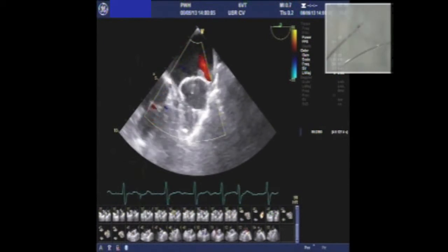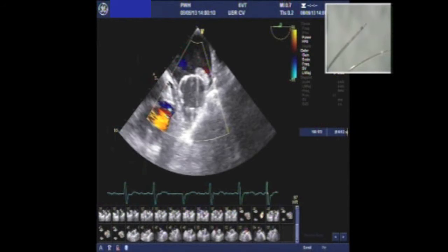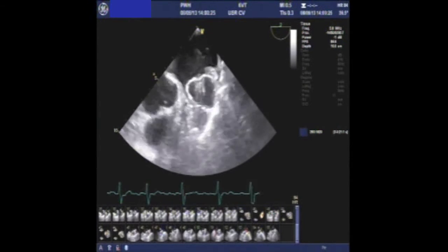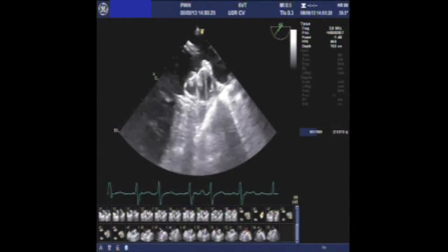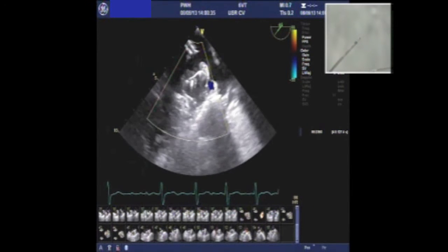Okay, at 0 degree there is no leakage here, and we measure the compression. For this view it is 25. Good compression. We need about 20% compression. 45 degree. You're right, in fact it goes down a bit. No leakage. Good compression.